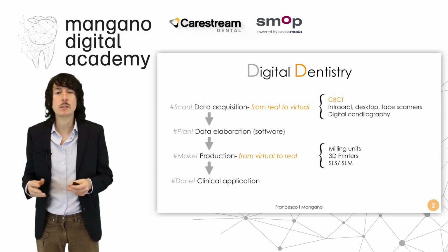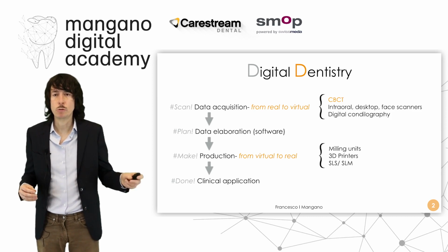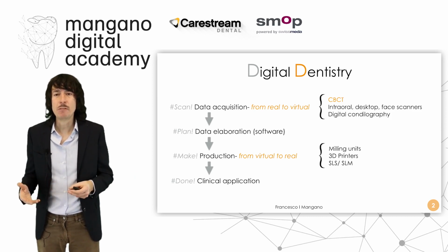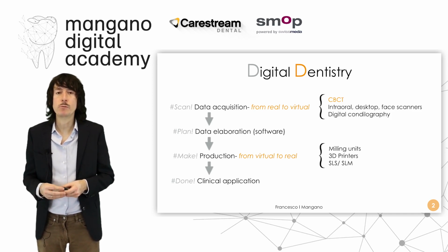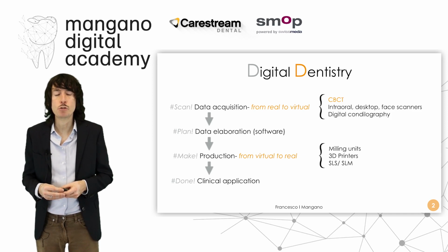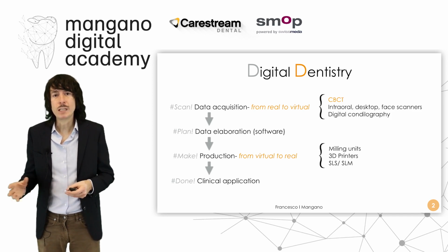in digital dentistry in the different possible clinical applications: prosthodontics, surgery, orthodontics. We have a scan phase with the data acquisition of our patient, 3D data, through cone beam computed tomography, of course, for the bone, for the hard tissues, but also intraoral scanners, face scanners are used, digital condylography. We go from the real to the virtual.